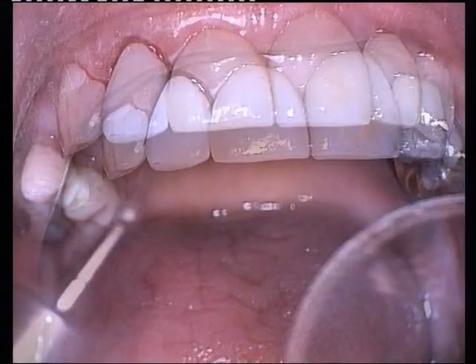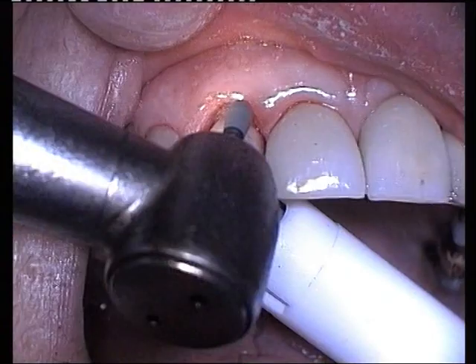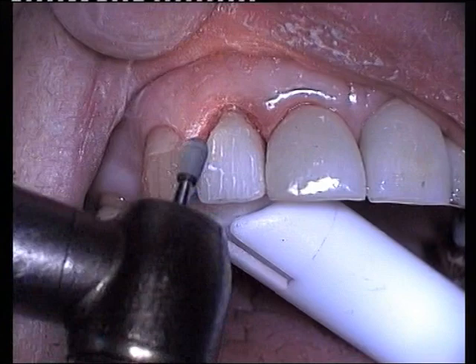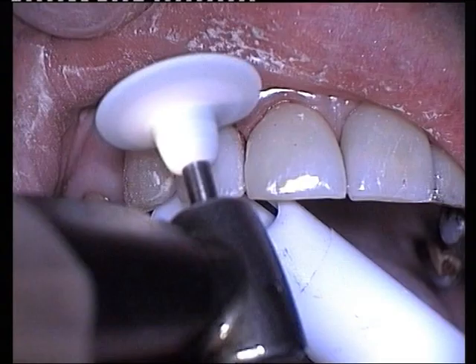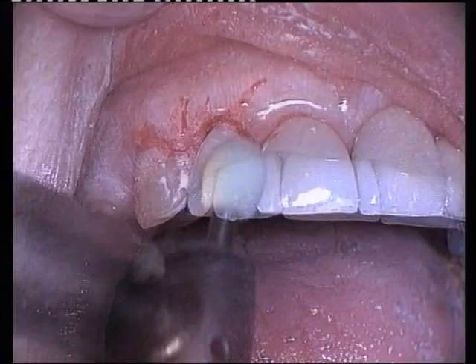Lingual adjustments are commenced using a slow-speed round diamond burr. After a final adjustment of the facial surface, a mounted high-speed pear-shaped stone creates the facial contour over the labial surface. A coarse silicon rubber wheel is applied on the facial and lingual surfaces. A fine silicon wheel furthers polishing the crown. The final polish is achieved with the fine soft flex discs.